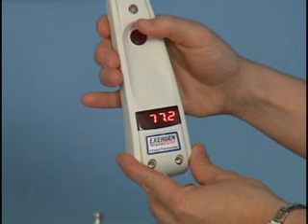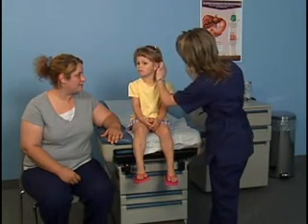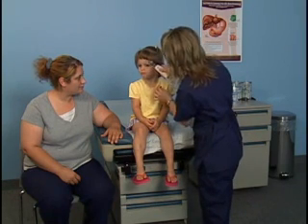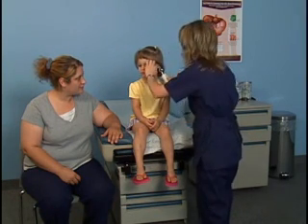You'll hear a beeping sound and see a blinking red light during the scan. These tell you that the reading is taking place. Rapid beeping and blinking indicate that the temperature is rising. A slow beep means that the thermometer is still scanning but not finding a higher temperature.